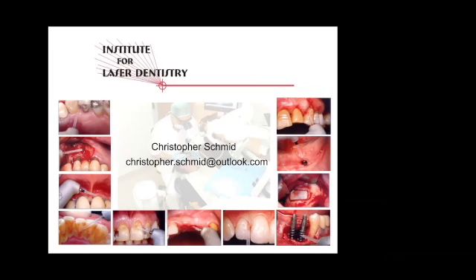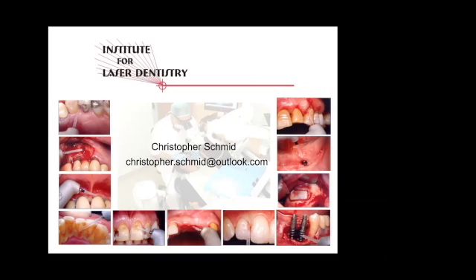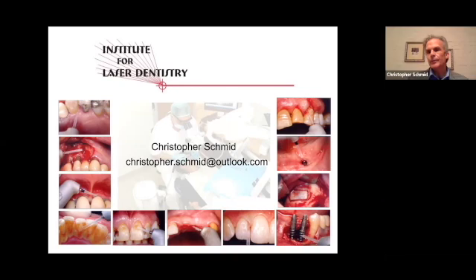And what do you do about sterilization and all that kind of thing? Of the device? Well, of anything that's going to be touching my glove or going into the mouth. Yeah, you can autoclave it. You can steam sterilize it. All of these handpieces are detachable, so you just take them off. Okay, does it have a tip that you put in and you have to touch it to something blue and all that? No, not the CO2 laser.